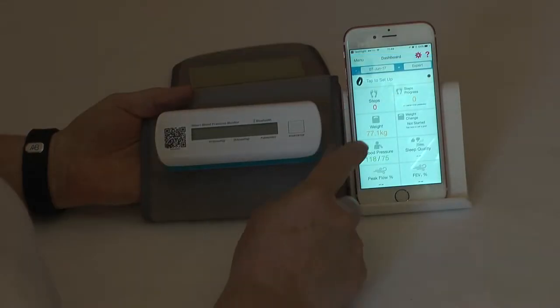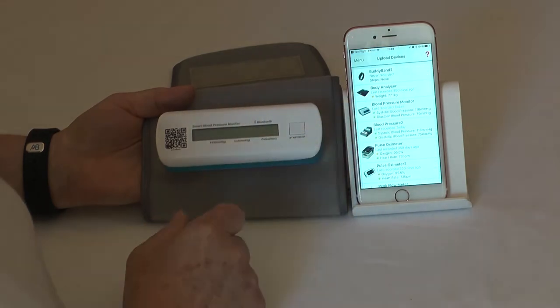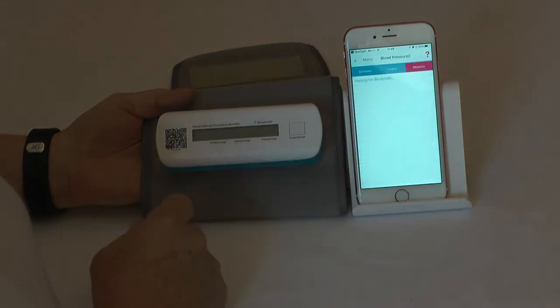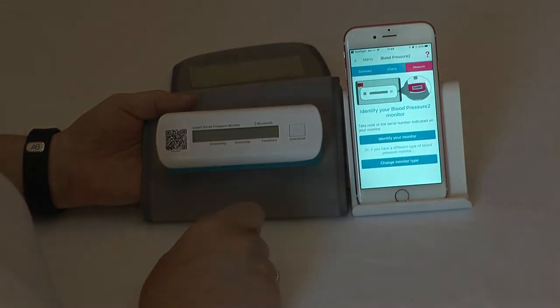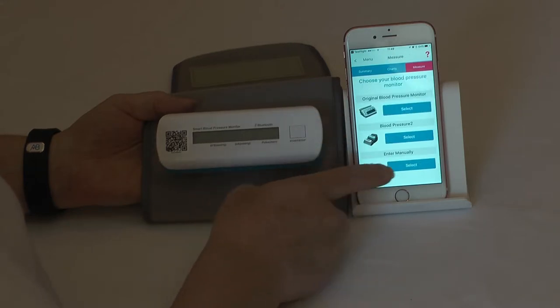To record a manual data entry for your blood pressure monitor, go to Upload Devices and press the Blood Pressure Monitor. If you cannot do the identification with a QR code and you want to change the monitor type, there you can select three ways of doing it. We'll just show you how to do the manual entry.